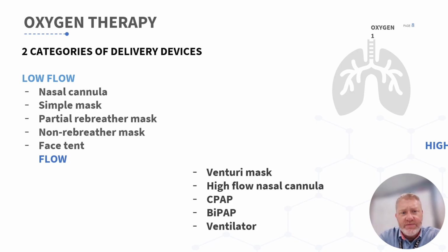So for the next few slides, I've integrated some of the slides that I teach for RCP 100 in the oxygen section. The difference between a low flow and a high flow device is something that most everyone other than RTs and hopefully now EMTs understand. I've had to do this teaching for nurses, even for residents. They just don't understand the concept.